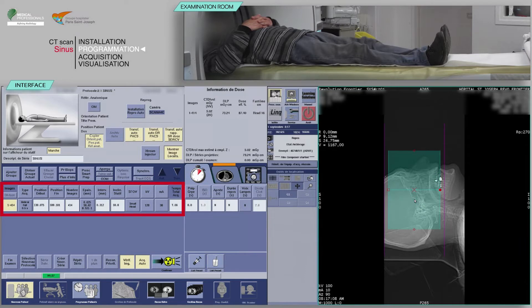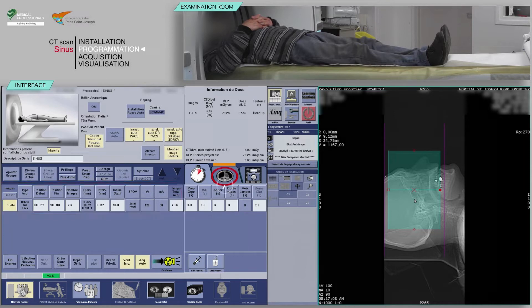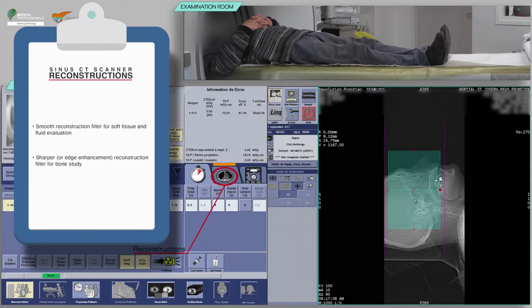Check the consistency of the acquisition parameters that are often pre-configured. Check the reconstruction boxes. For the acquisition of a sinus scan, you will need at least a smooth reconstruction filter for soft tissue and fluid evaluation and a sharper or edge enhancement reconstruction filter for bone study.